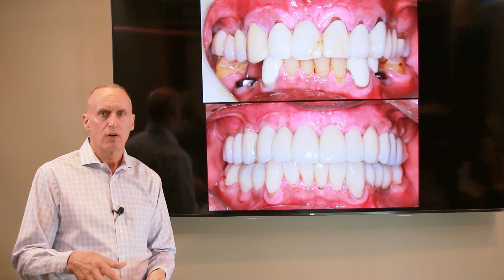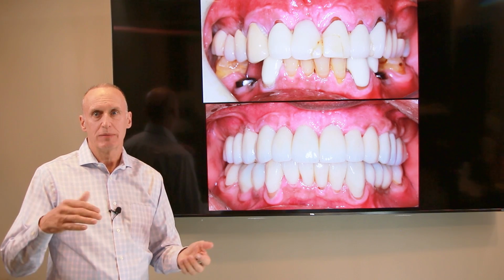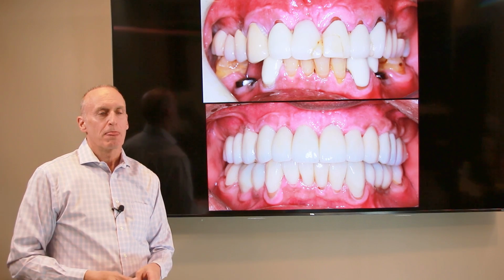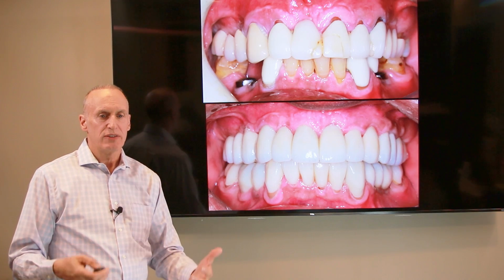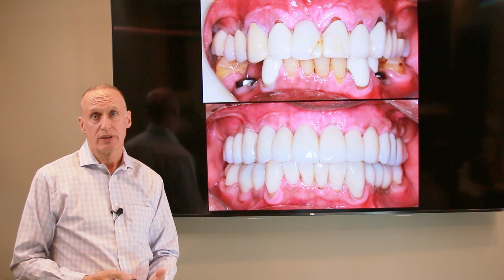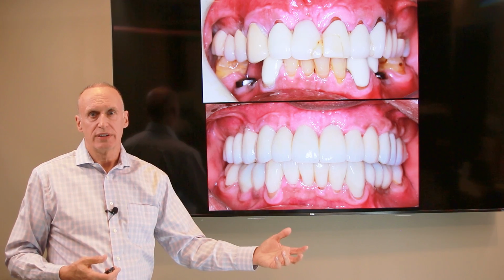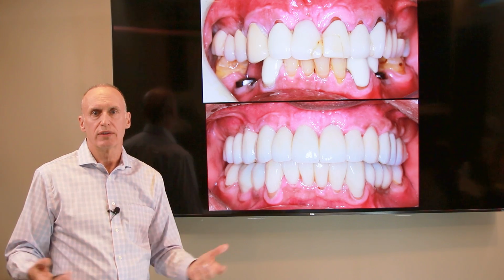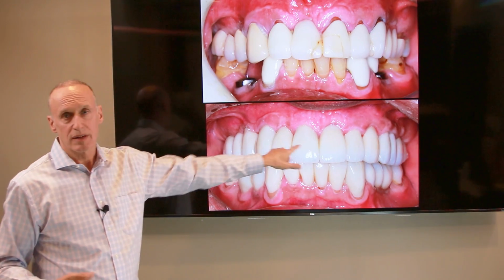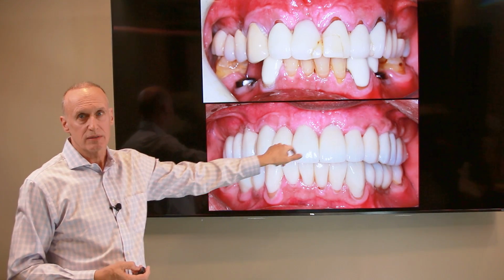The All-On-4 protocol, they will never use any existing implants that you have. Because again, the implants, when you're taking that much bone away, the implant's going to stick up like a tent pole. I would say in cases where our patients come in with reasonably well done implants, we use them probably 80 or 90% of the time, if they're reasonably good. I see no reason not to. Many of them have been in there for years or a decade or more, so why not use a healthy, good implant if you can? So I used all of his implants, but placed a whole bunch more in his upper jaw to give him this result. So before and after, and you'll notice no pink here.